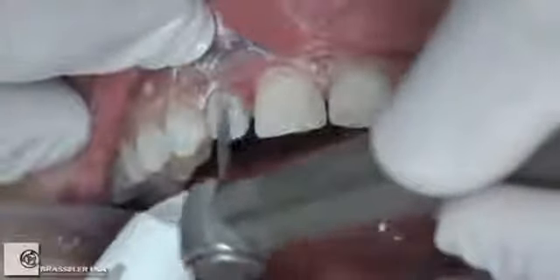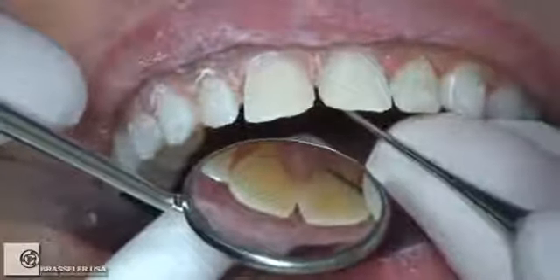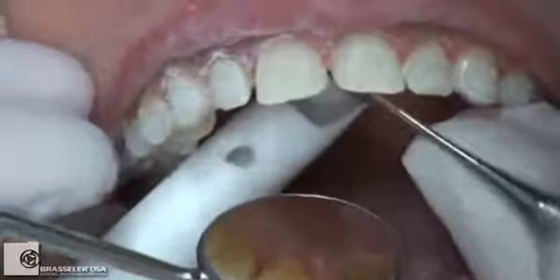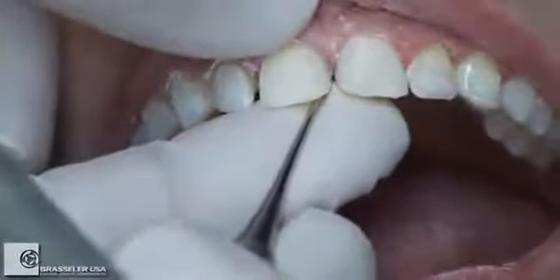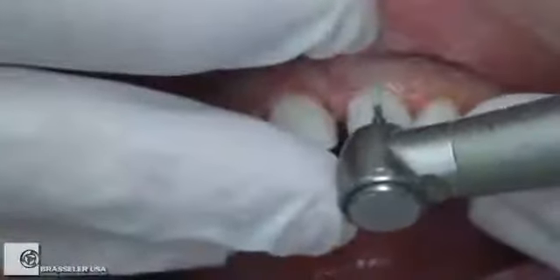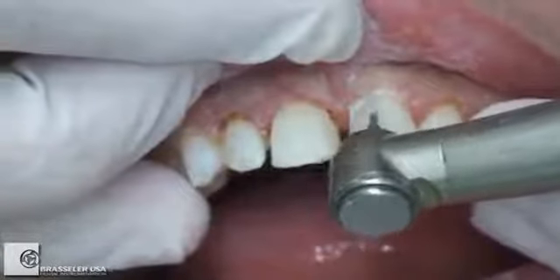I'm cutting a little bit dry there, really because of the video. We were having a little bit of a problem with light getting, water getting on the camera. So I'm just removing the remnants of the composite at this point. We let a little composite go over onto the lingual here just for mechanical grab. She'd also had a previous bonding to close that interproximal space that we're going to go ahead and remove, and that was done by a dentist prior to me. I try and scale it off first if I can. If it doesn't relatively easily scale off, then we're going to go ahead and remove it.